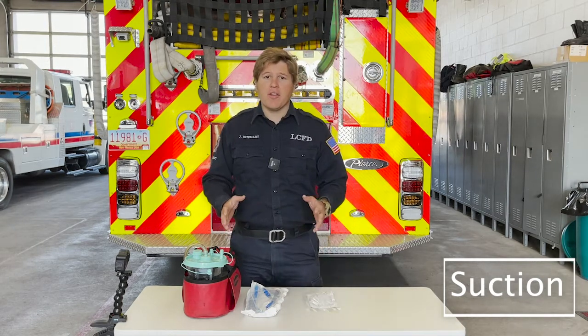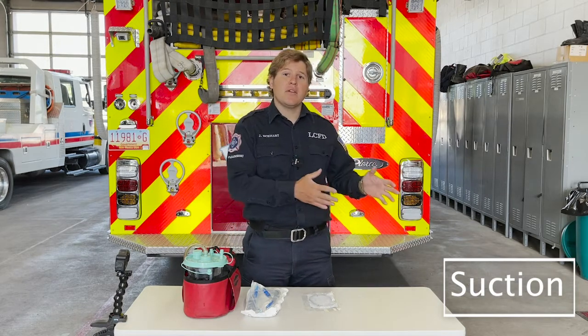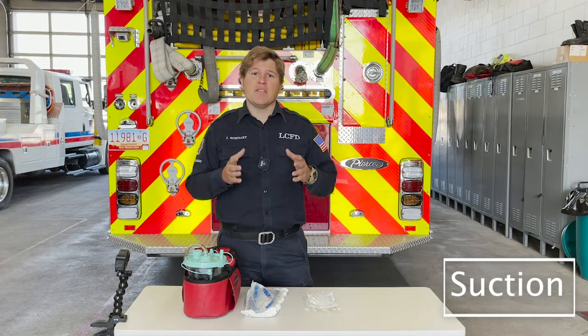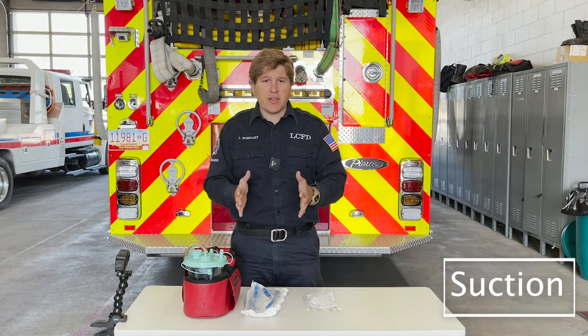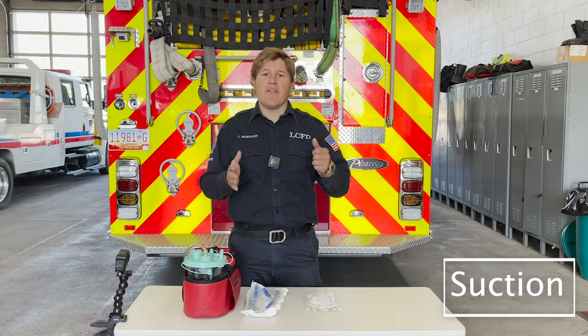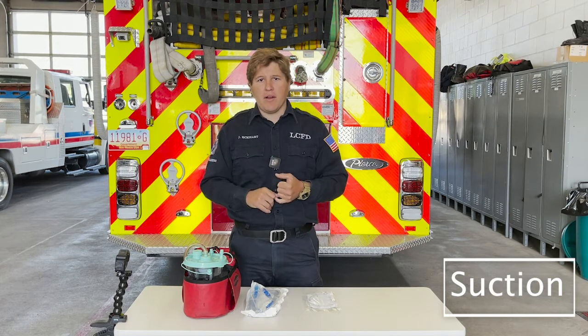Having these things ready to go, that's the number one thing when you look at failed intubations with our video laryngoscopes: not suctioning the airway. So it's something that I do. It's something that I have ready to go when I first look into the airway, whether there's vomit or not. I have that suction on. I have the Yankauer in my hand, ready to go to suction even saliva out of the airway.